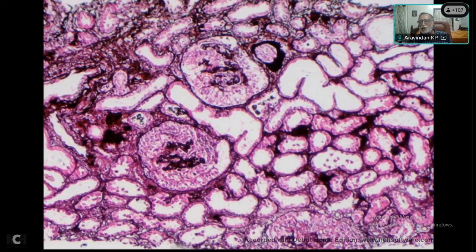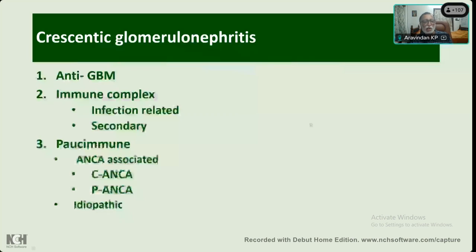See, again, it depends on the sampling, but I would be comfortable with something like 50% to call something crescentic glomeruli, because many other conditions can have occasional glomeruli with crescents. Suppose you have just a biopsy with two glomeruli, one is a crescent, the other is not, then you are not really very sure. So such cases have to be sampled very well to really know whether it is really crescentic. Of course, the clinical picture would help greatly. So when you are dealing with a crescentic glomerulonephritis, it may be anti-GBM, it may be immune complex related, or it may be pauci-immune, which is usually due to ANCA. So, what next?